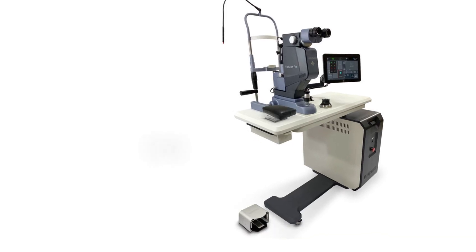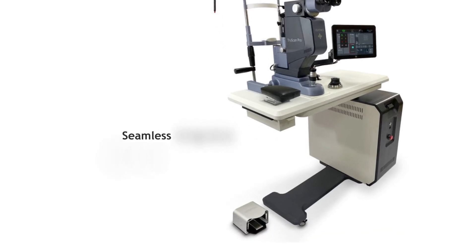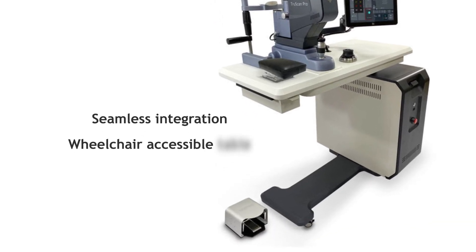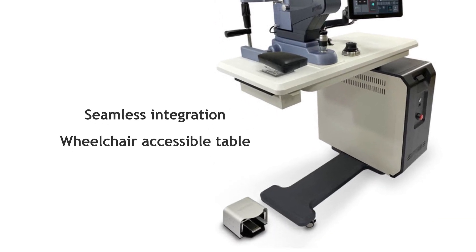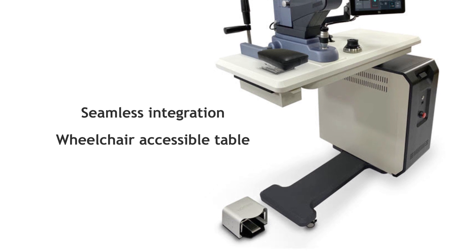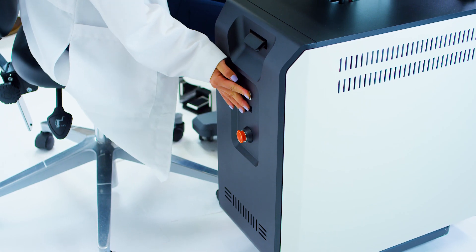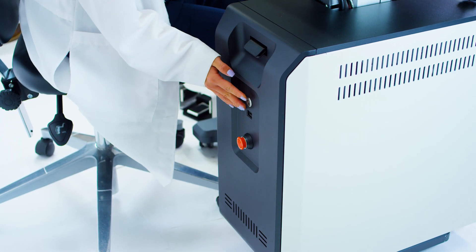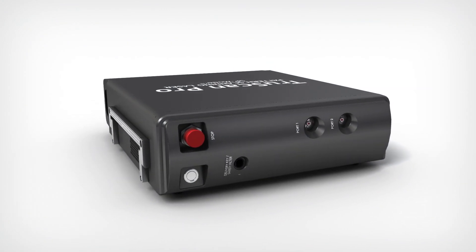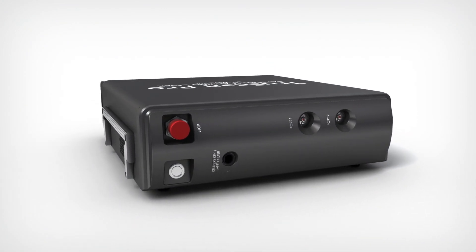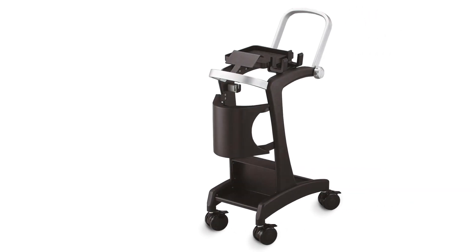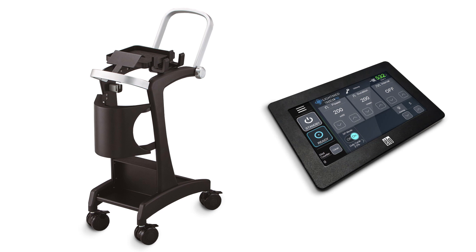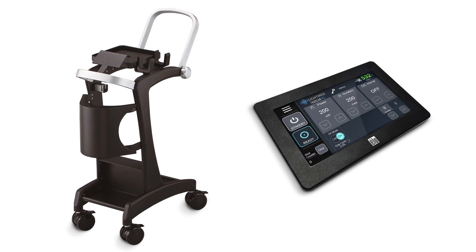The slit lamp integrates seamlessly with LightMed's new ergonomic and wheelchair accessible table. The smart table allows physicians to easily detach the laser console and take it between rooms with an optional compact mobile cart and portable remote control touchscreen.